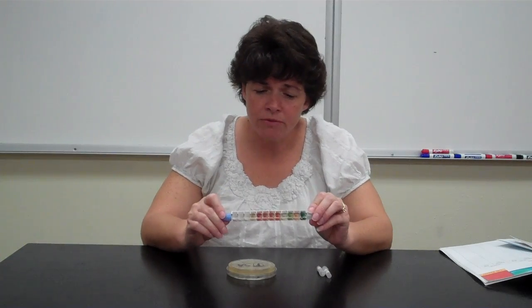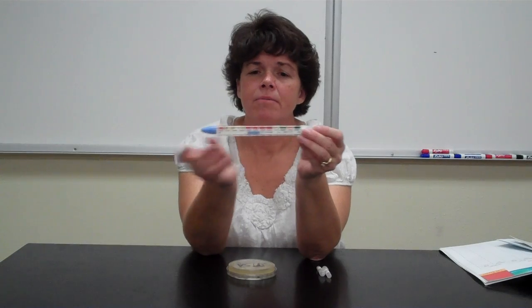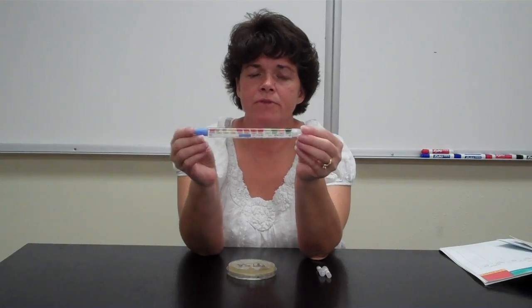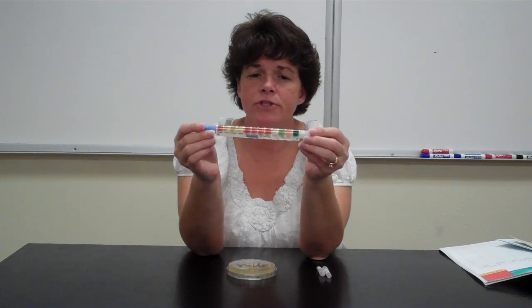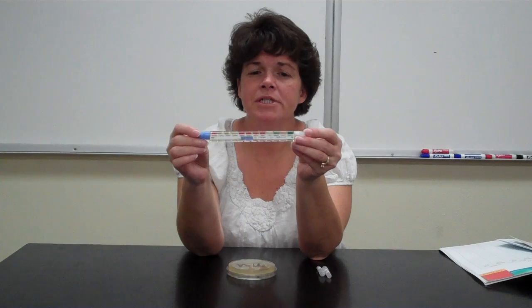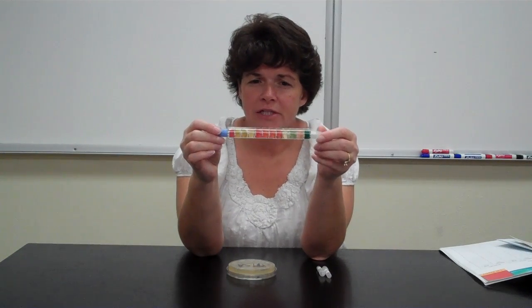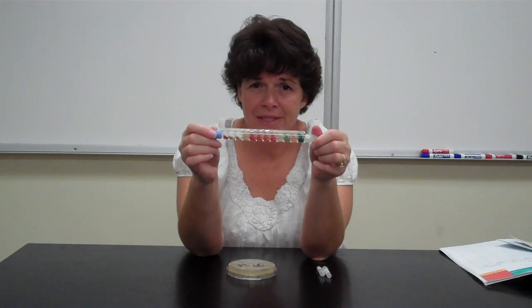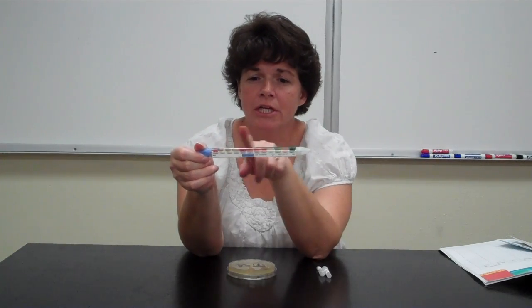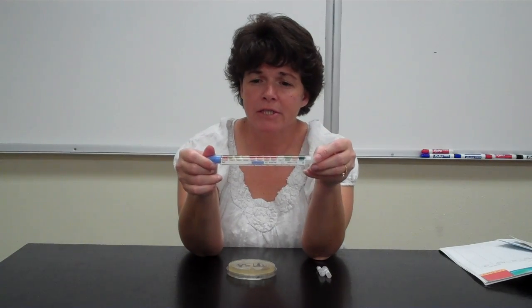So what you're going to do with this one right here is, hopefully you can see the colors. Here we have the differential media, like the fermentation tests. And then we have a protein test and some other ones down here. With these particular tests, you're going to run your bacteria through this entire thing, and it will change color or not change color in each little compartment depending on the actual species of bacteria.